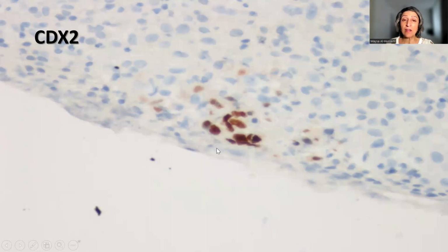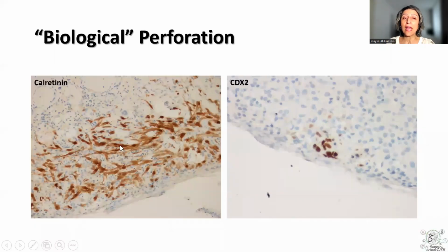Now, in this particular case, elastin was not really helpful. So remember that you can utilize calretinin and CDX2 to show or to support that this is perforation.